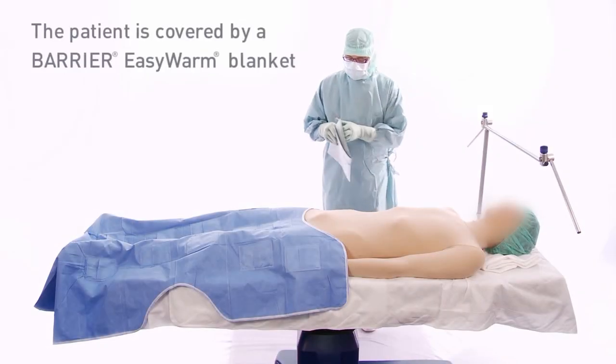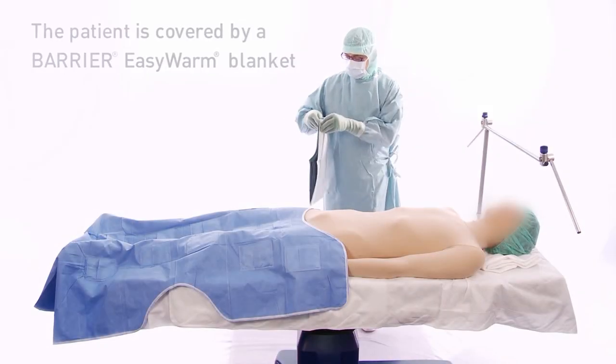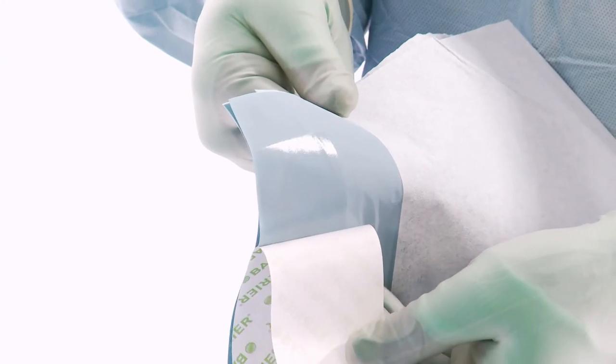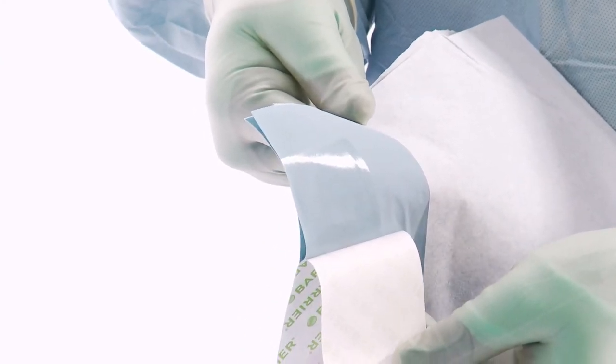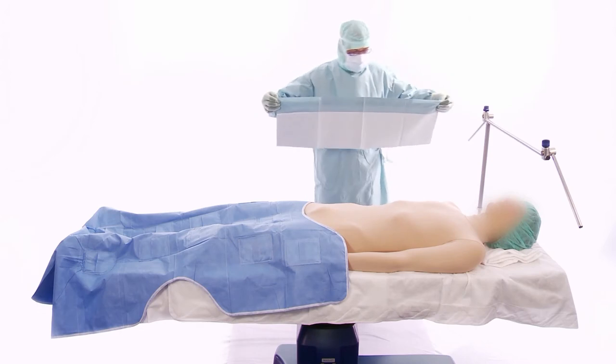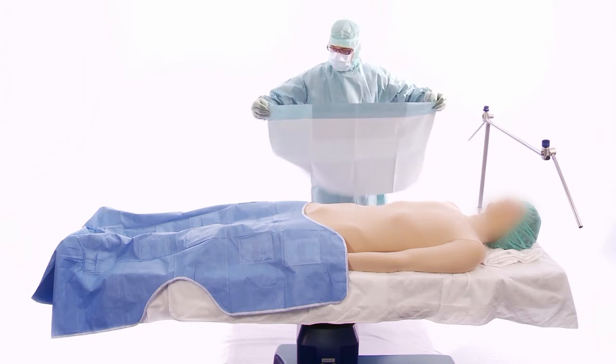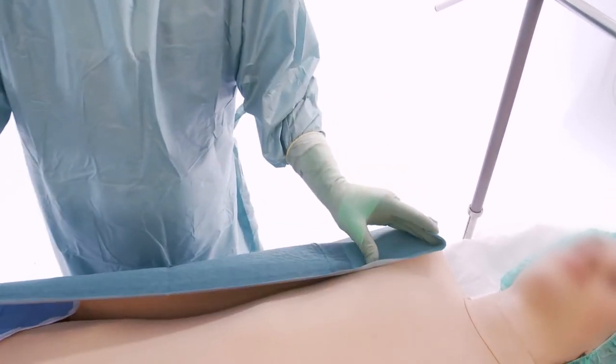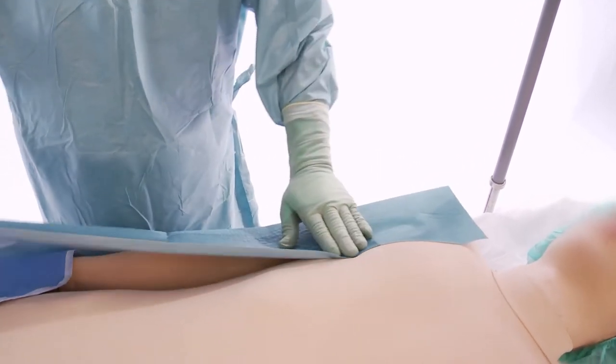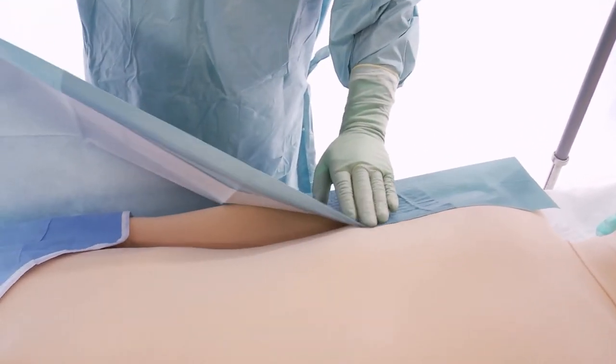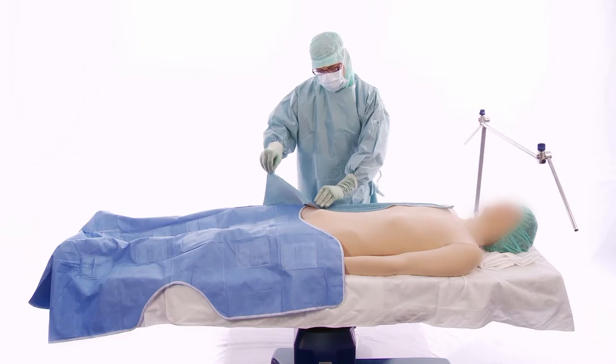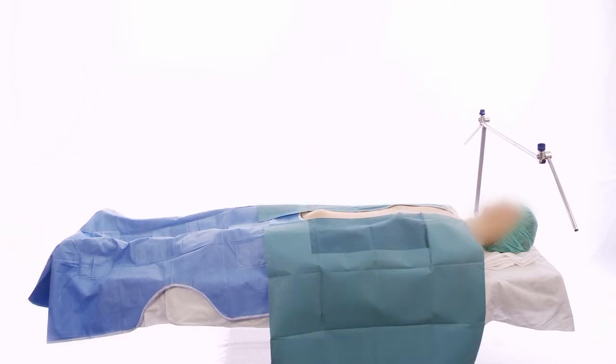Start by removing the release paper from the side towel. Note the finger lifts for easy handling. Unfold the towel and hold it firmly. Start at one end and apply it gently to the lateral side of the patient. Do the same on the other side.